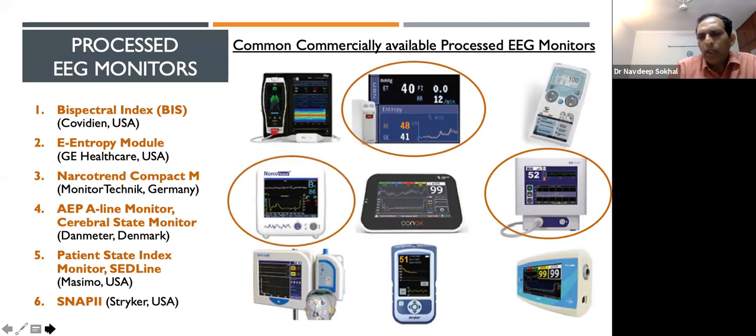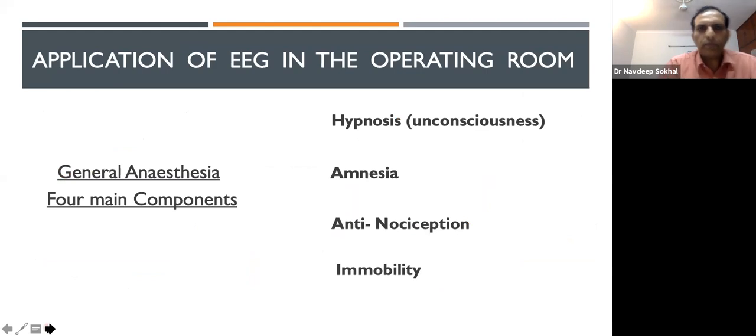All of these monitors have the same basic principle of working. Let's see one by one. What is the application of these EEG monitors in the operating room?